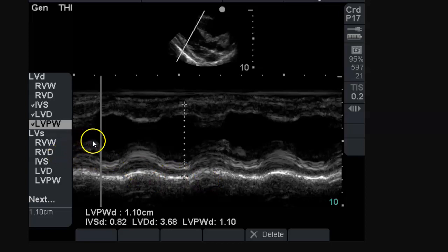And as things such as the structure of the heart are moving, we see those changes in time on a frozen image. So it takes the PRP, pulse repetition period, amount of time to make that one scan line. So therefore the resolution in time that we're seeing is the PRP.